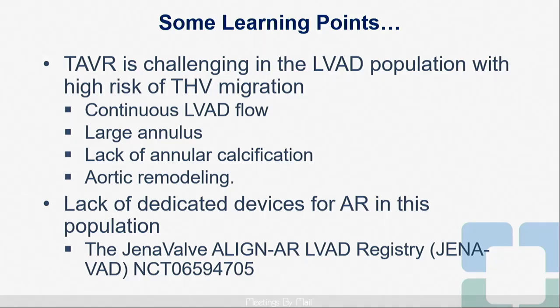Yes. One question here from the panel. So, Mauricio, I'm just curious. So you decided to put a Sapien in with the goal of stabilizing and expanding. Correct. Why not try a balloon? You were worried that would destabilize the valve entirely and it would fall into the ventricle?